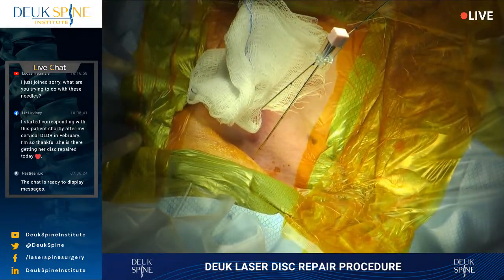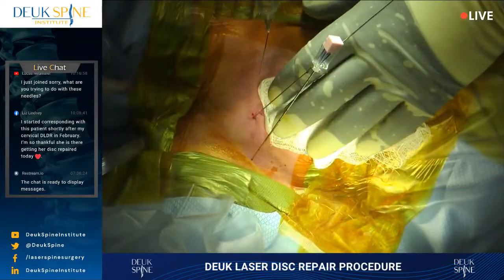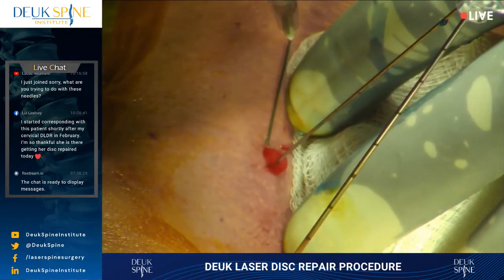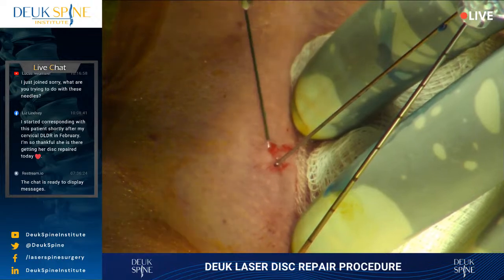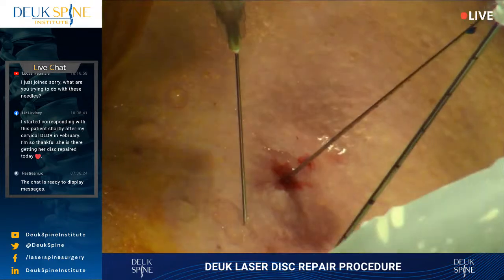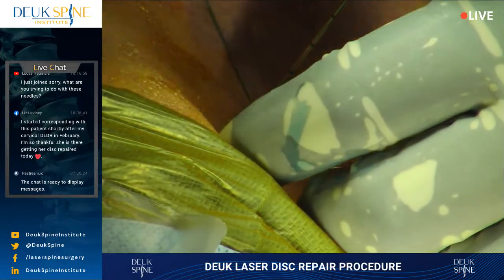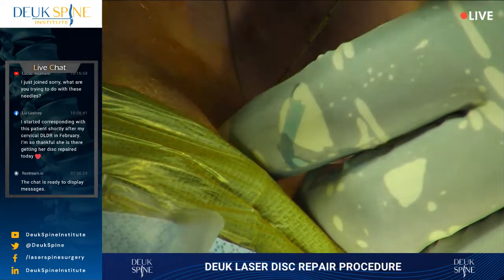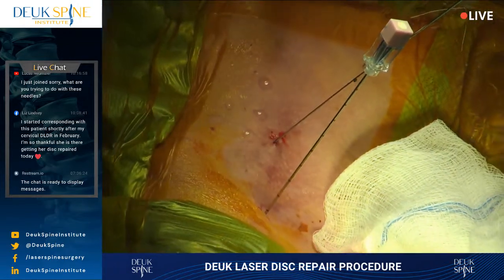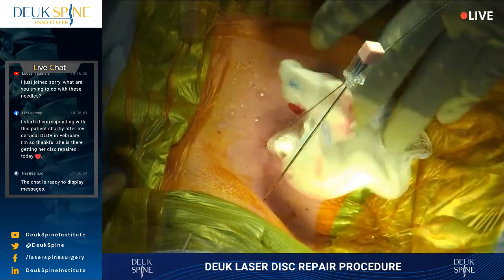Okay, everything looks good. We've lost like 2 drops of blood. That's less than 1/10% of a milliliter. It's nothing. You can see we're going to inject a little bit of local. This is just some lidocaine with epinephrine, just to numb up the skin and to arrest any capillary bleeding that might occur. Most of it's leaking out through the needle hole. You want to be careful not to go deep, and you don't want to inject this into a vein, obviously, but you want it sub-Q. I injected about 1 ml sub-Q. The rest of it's leaked out.